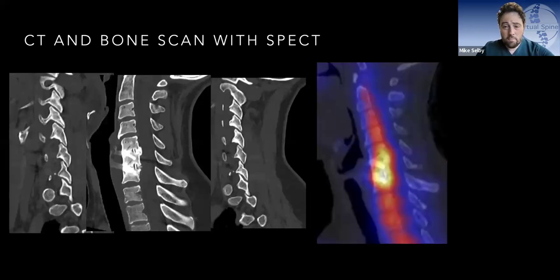This, to me, is the best possible test for diagnosis of non-union in the spine. And this is a high quality bone scan with SPECT. And this shows intense ongoing activity. Now we are 7 years down the line in this area.